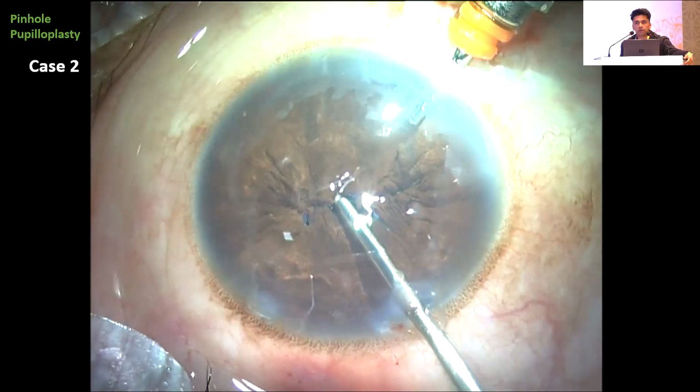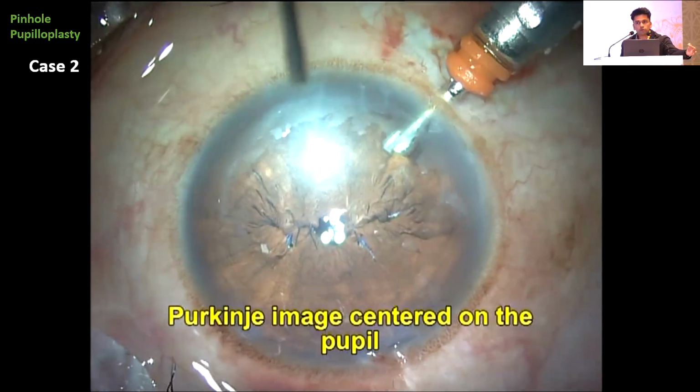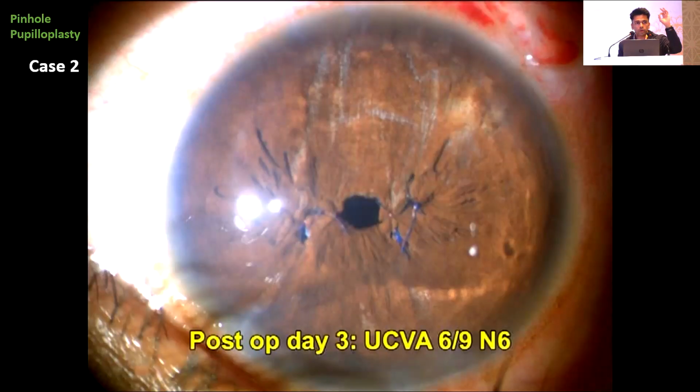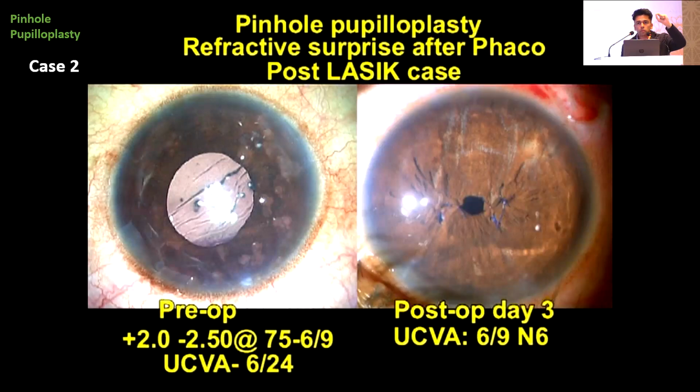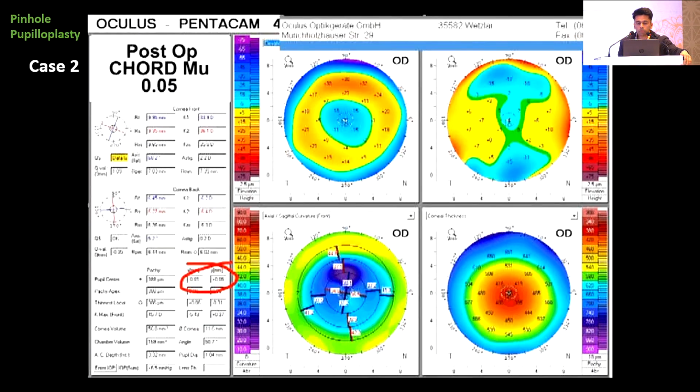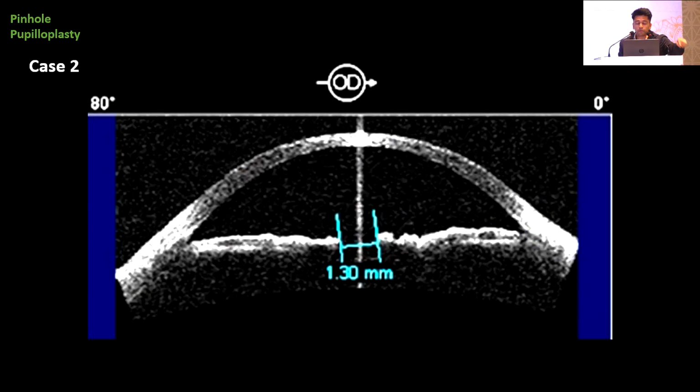Here we are giving a very sure form of success rate, but you've got to get the technique where you close the pupil size down and then open it up, because it will become a cat eye. You open it up and make it a circular 1.5 or 2 millimeter. What I tried to show in the last images of this video was that you can even get a really good field of vision. It does not hamper the field of vision.